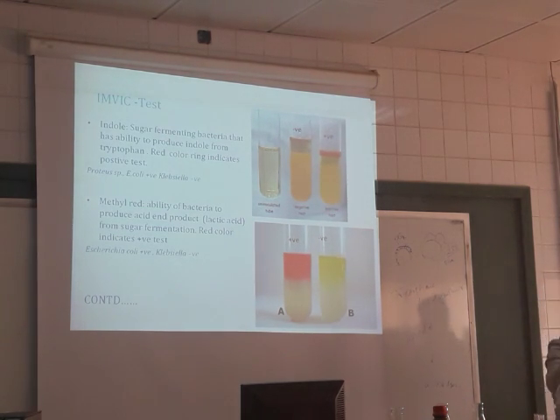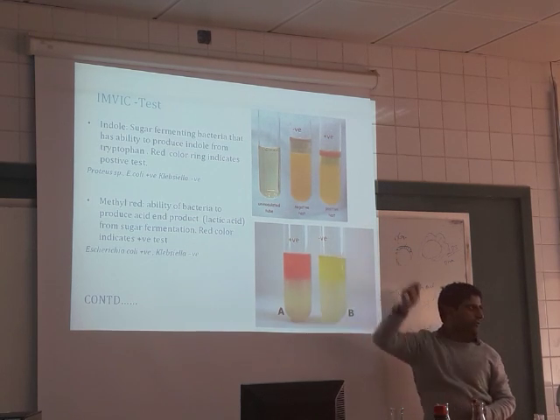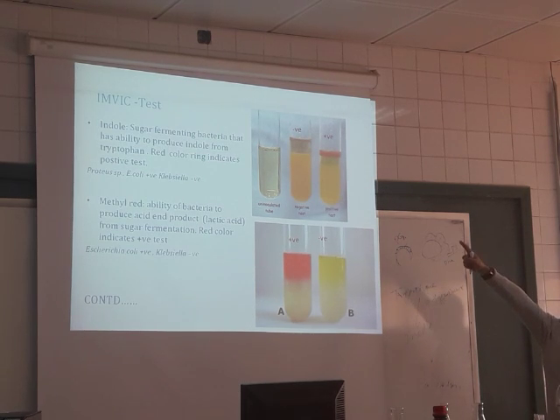If bacteria have the enzyme tryptophanase, they will break down tryptophan and form indole. Indole is a ring-shaped compound. You see the ring is formed on the top. The ring formed is positive in the indole test. If this ring is formed, it means the bacteria have the enzyme tryptophanase. It has broken down the tryptophan into indole, and indole forms a ring. Next day after culturing, you will see it present here. Understood indole? What's the indole test?